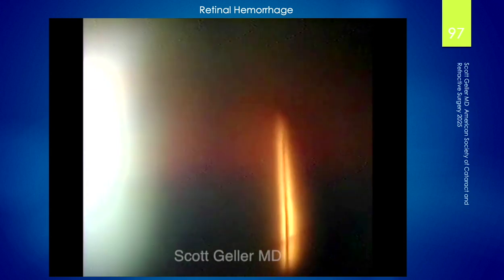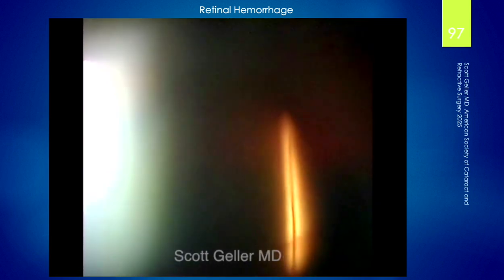The flow is decreased, and the interesting thing about this is the patient never noticed anything, didn't notice what you typically would get with a vitreous hemorrhage. I just told the patient I had to put pressure on the eye because there was a little capillary that was oozing. I didn't scare the patient. I didn't say to the patient, oh my God, what's happening here? I just kept my cool, put the pressure on the lens.